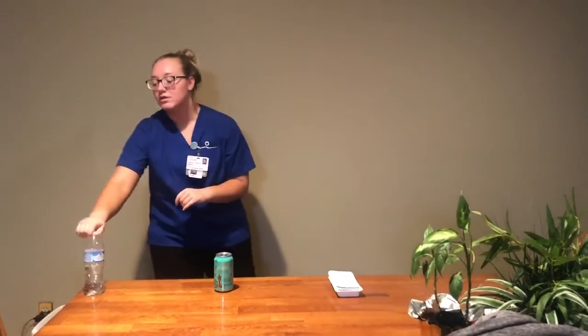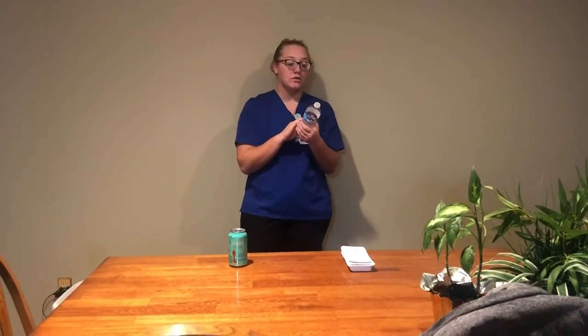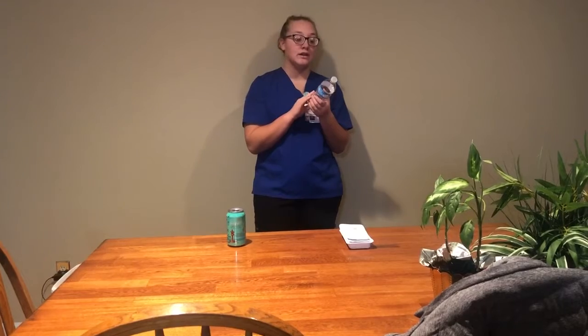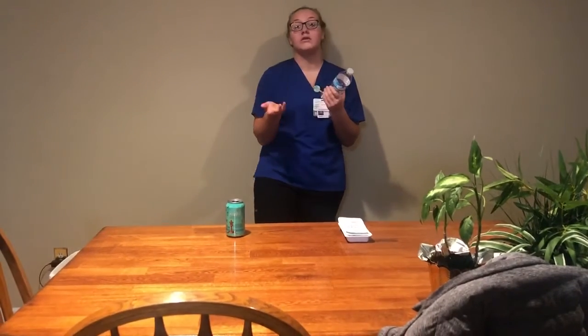Then after that, I'm going to check my sterile solution. The dose is however much is needed, the route is trach, the time is now, the reason is to moisten my catheter, the individual is Miss Smith, and the medication is normal sterile saline. The expiration date is 12/0/21. I would also make sure that it has not been open for longer than 24 hours.